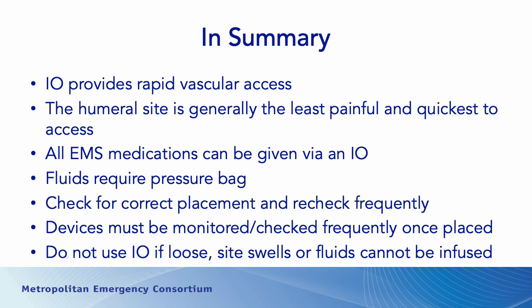Again, devices must be monitored and checked frequently once placed, and do not use an IO if it's loose, if the site swells, or fluids cannot be infused. In any of these circumstances, I would stop using the device and leave it alone, let somebody else take it out, or if it's in the way, you can take it out. But I definitely would not use it if you have any of these things present.